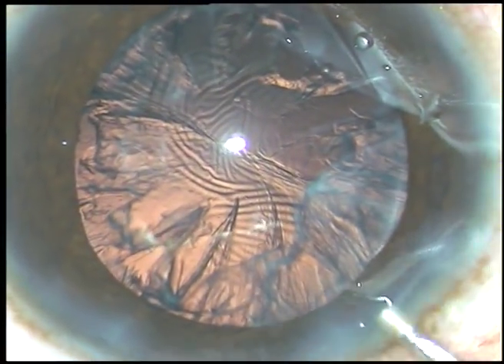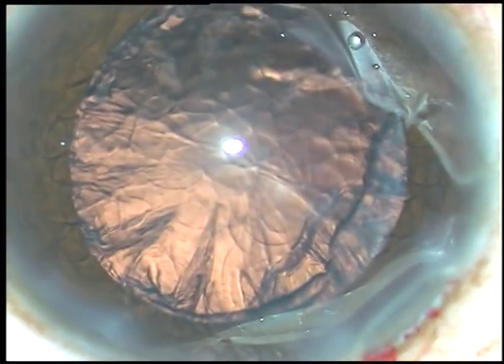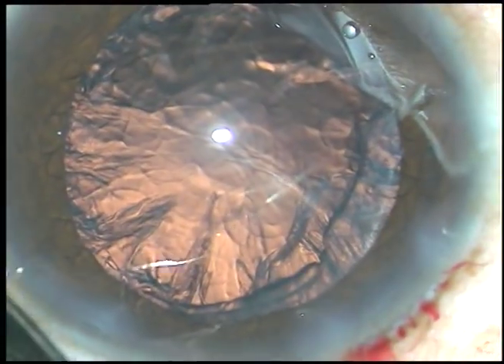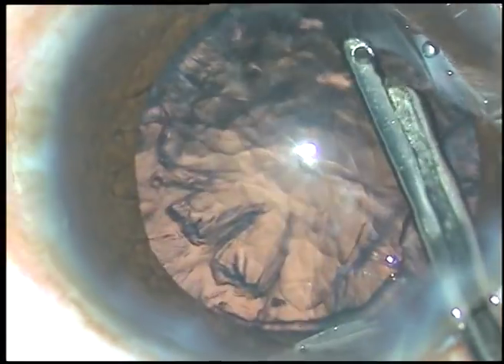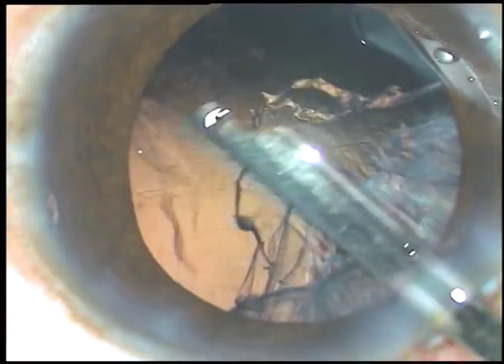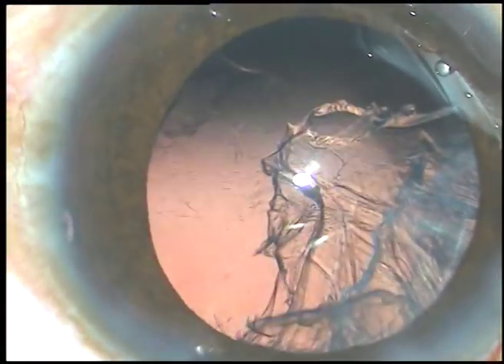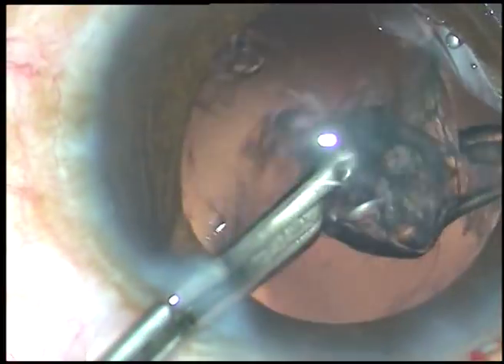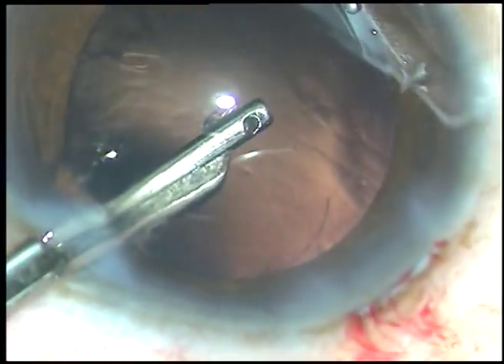The nucleus has been managed and this is the cortical lens matter. A 23-gauge Simcoe cannula is being used to remove the cortical matter. I am going through the side port to remove the sub-incisional cortex, and here it is.